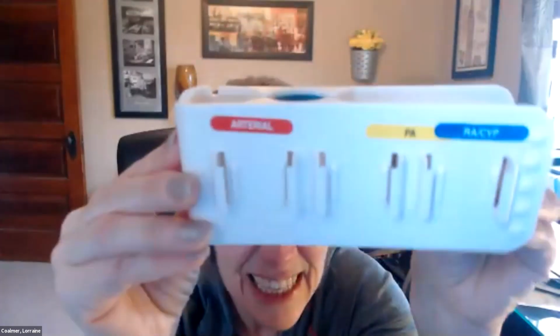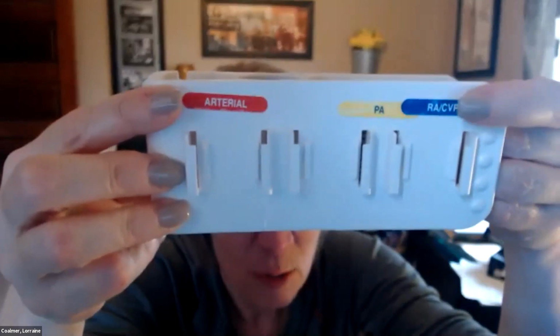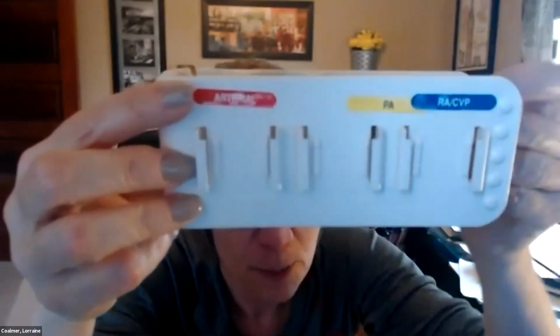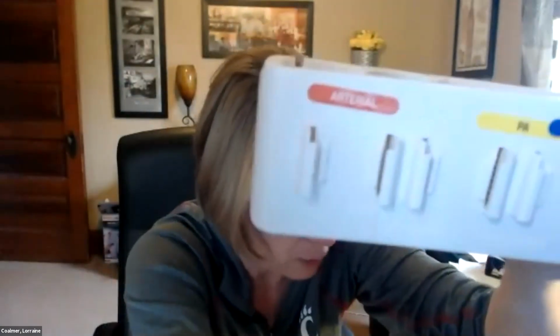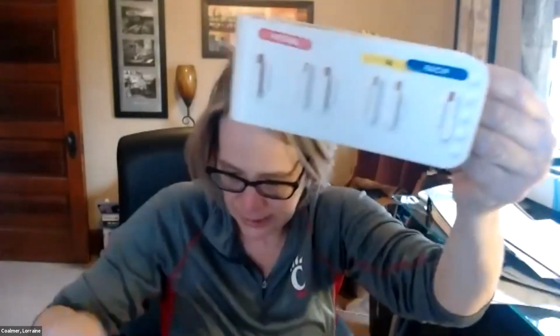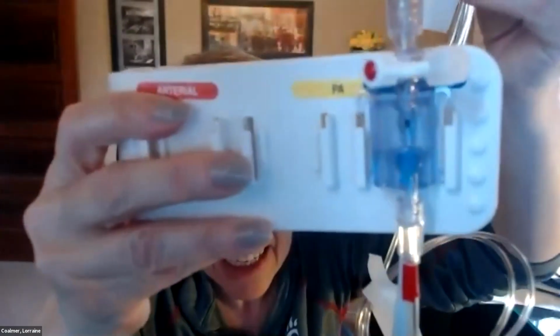Now, when I said claw earlier, that's this. And if you look, we label by colors. Arterial over here, right atrial pressure, and then the yellow is pulmonary artery pressure. We will put the transducer into, I don't think I could do it backwards, so here, and it sits in there. Do you see that? It sits in there.